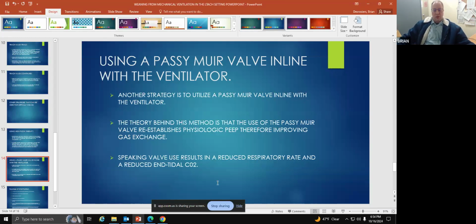Some other things we look at, we usually try to have a continuous pulse ox on the patient at the bedside. And we're always monitoring the patient. But what I want you guys to know is that sometimes numbers don't mean failure.